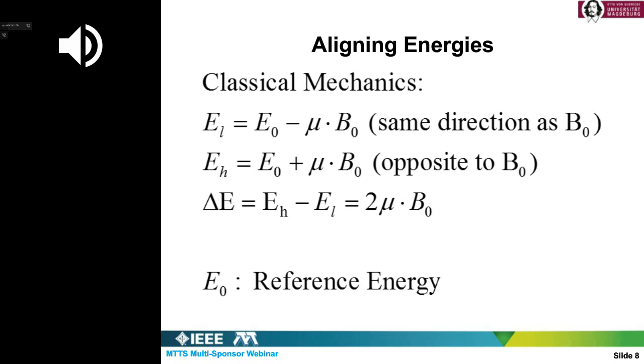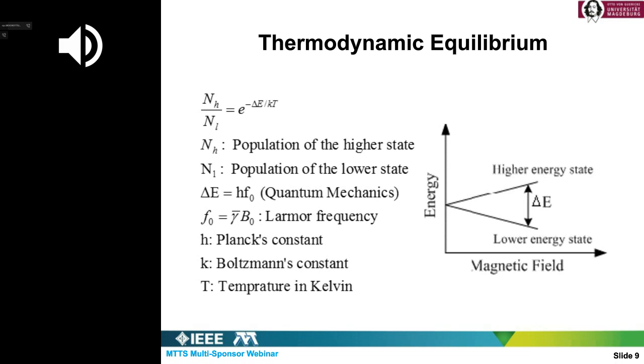challenge. Now let us come to how much is the difference between parallel minus anti-parallel, because actually what you measure outside the body is this difference. So Boltzmann gives us the statistical distribution. If you have two energy states, the number of particles in the higher energy state divided by the number of particles in the lower energy state obeys the Boltzmann distribution, which is e to the minus the difference in the two energy states divided by the Boltzmann constant times the absolute temperature.